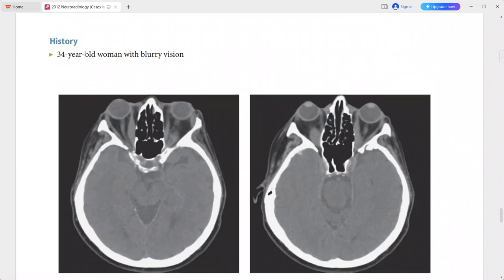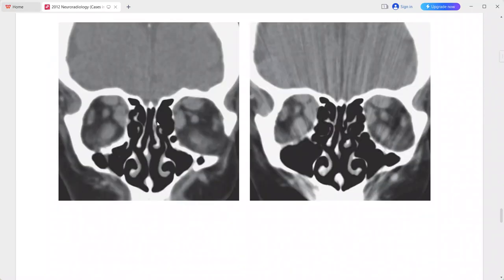The enlargement tends to involve the muscle bellies only, with sparing of the tendons, resembling a coke bottle appearance. There is also mild proptosis. This is a case of thyroid ophthalmopathy.